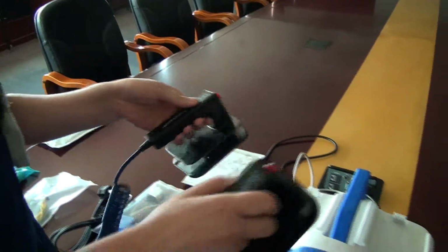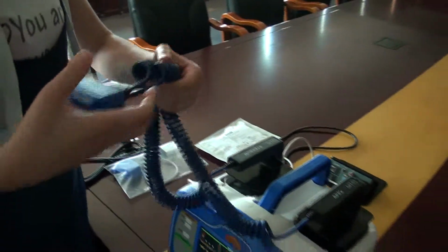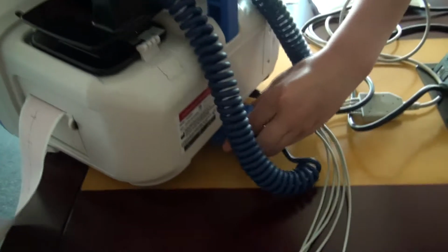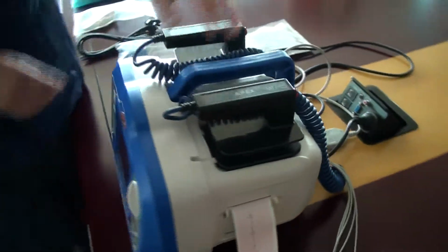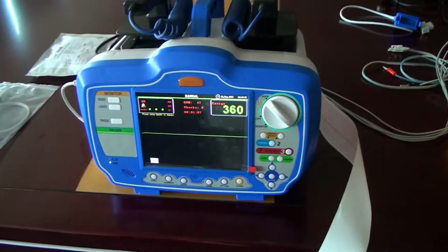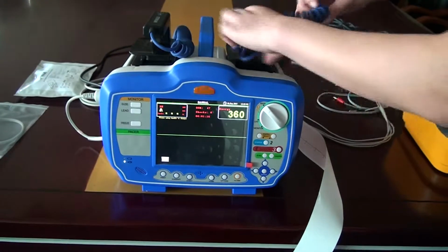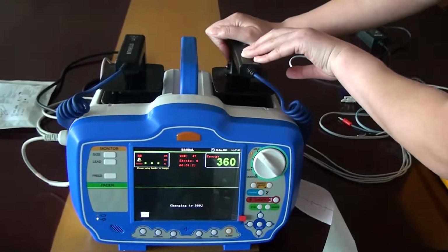Now we connect our handles to the device. For this screw, it is down. This one is up. And to use the handles, you just need to press the yellow button to charge.